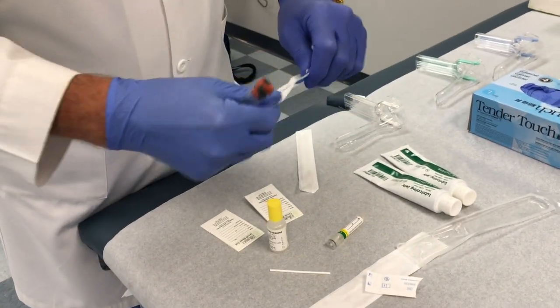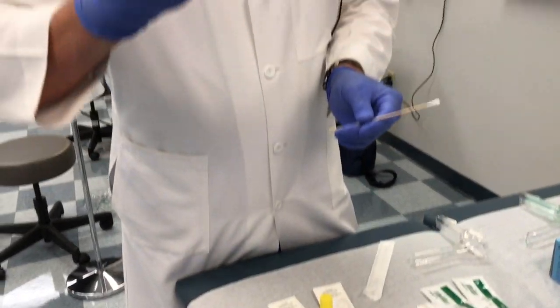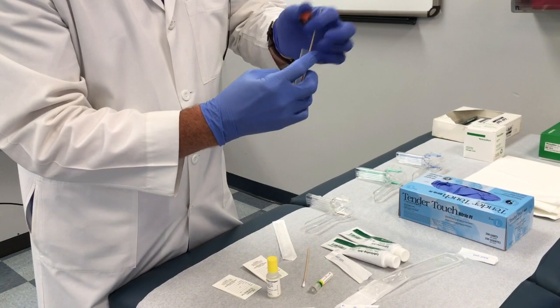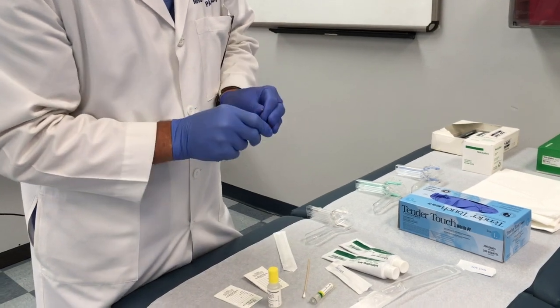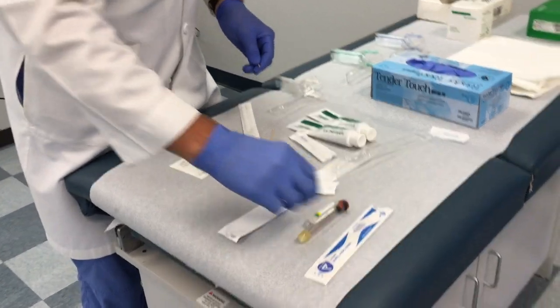There are two swabs. The second one is going to be in the vaginal vault itself — we'll go around the posterior superior fornix, and then this will go into the tube with its medium, broken off, and sent off to the lab. So there are actually two different collections: one for GC/chlamydia and one for trichomonas.